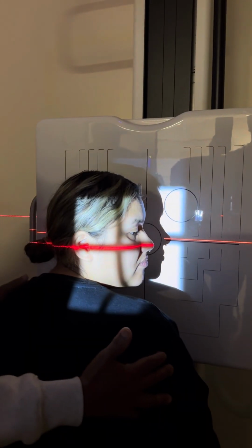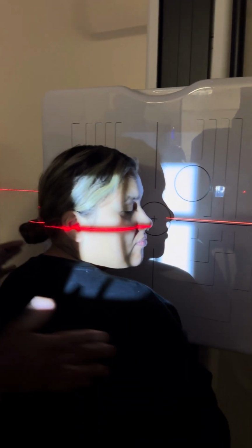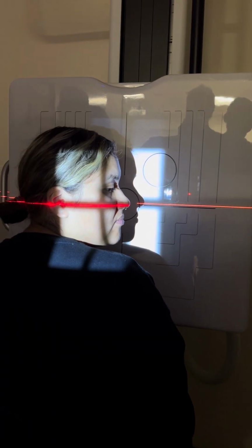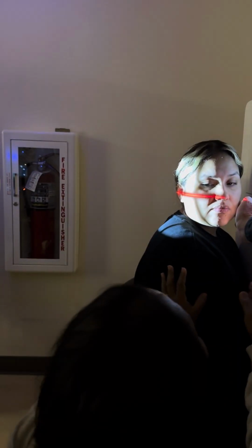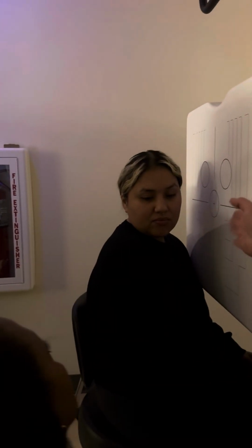I'm not worried about that. It's your job to read the chapters for me. More likely like that, am I right? See how her chin needs to come down a little bit, and her cheek out just slightly? Yep, drop your chin and then come out here a little bit. Sorry, I'm pushing on your face so much. See the difference? I want that plane to be parallel with this.